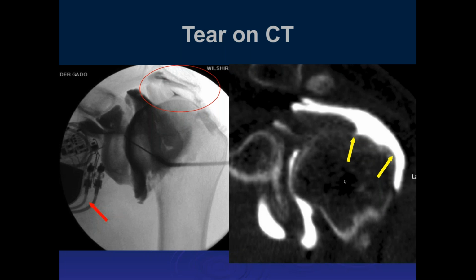And we did a lot of early MR of cardiac disease, and somehow we ended up scanning a number of patients with pacemakers that we didn't know had pacemakers. And we had no problems with any of them, and none of the pacemakers were damaged. So I've always been skeptical of the people being adverse to doing pacemakers in a scanner.